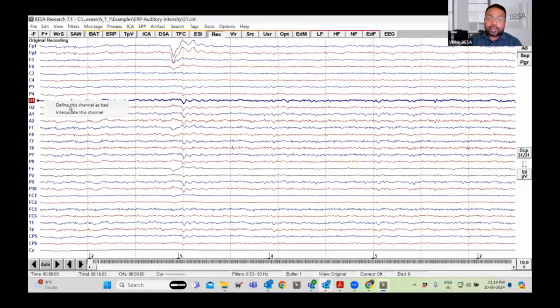If it is not bad throughout, and you also see that it is just bringing up some kinds of artifacts, then you may want to interpolate that channel alone. In that case, you can just click on interpolate this channel, and that channel is going to get interpolated. When you interpolate it, you will see this channel labeled in a purple color, which will show you that the channel has been interpolated.